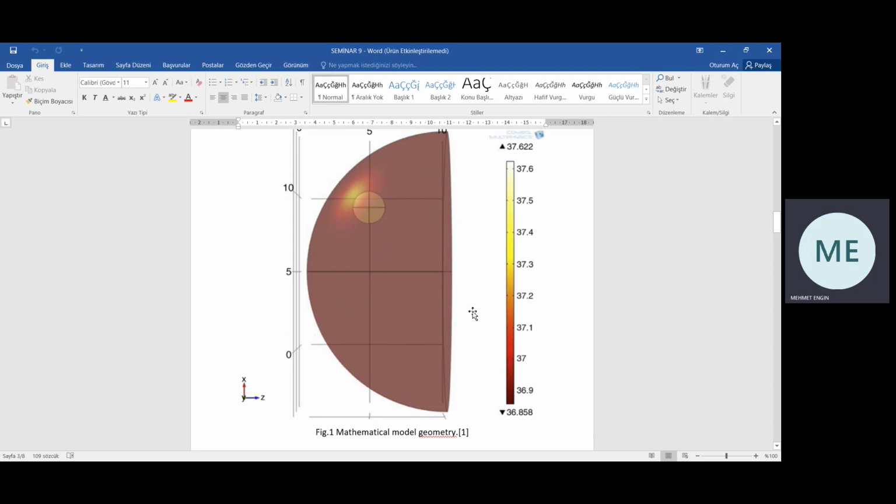The boundary condition of the system was the heat exchange by the concave part of the system, while initial conditions were set to a temperature equal to 309 Kelvin.